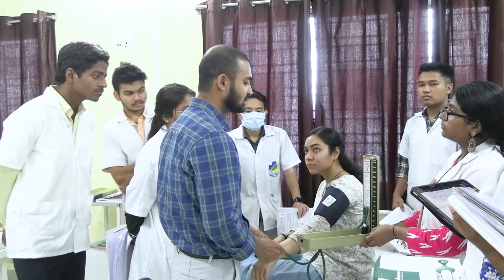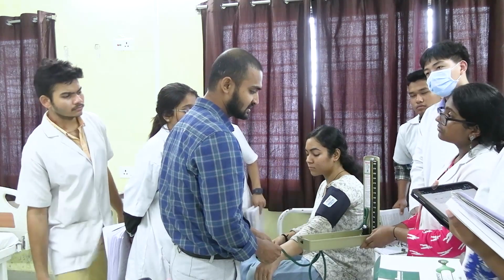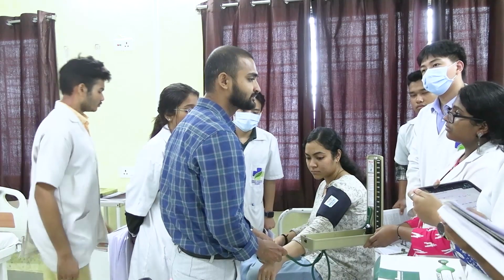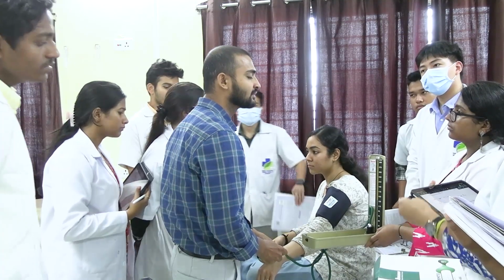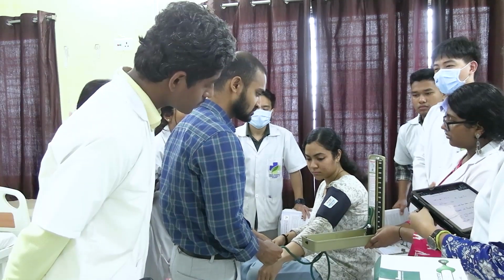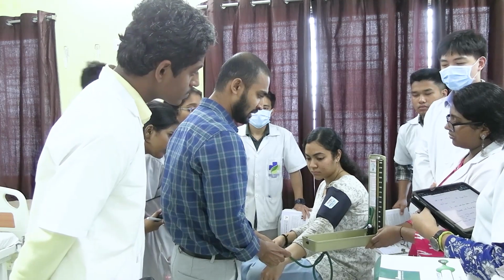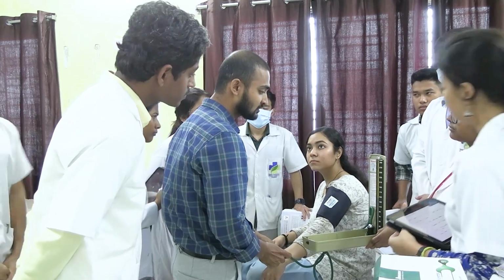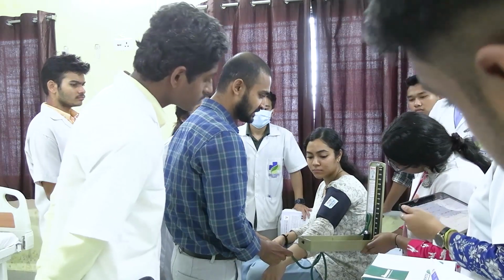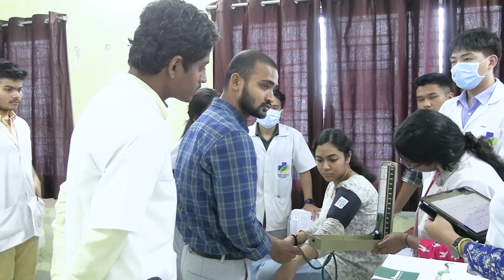Now after increasing the pressure to a certain extent, at a certain moment the pulse will disappear. That means what? The artery is blocked, the blood flow has been blocked. Suppose I am not getting the pulse around 150 mmHg. Now I will slowly deflate. The deflation rate should be 1 to 2 mm per second.